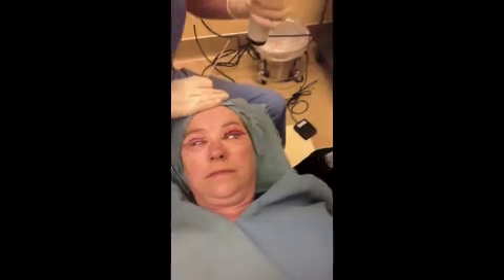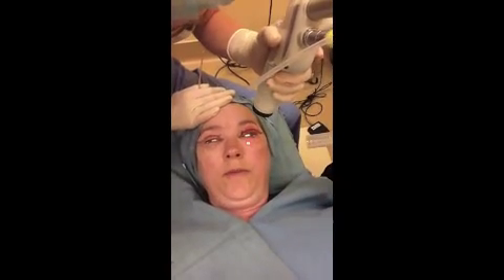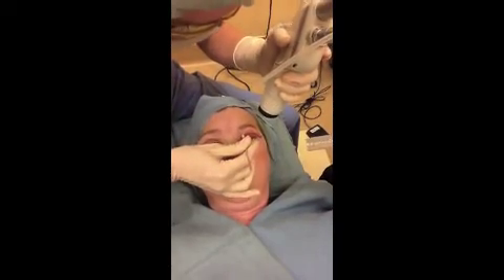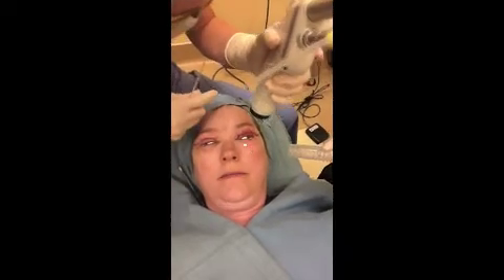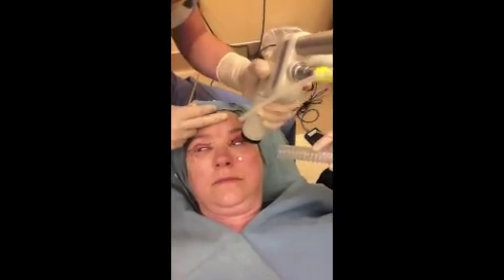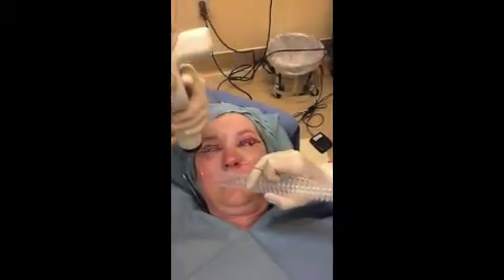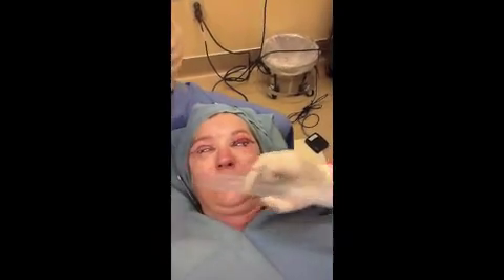Let's look for symmetry. Pretty good. Can you tolerate me going just a little bit down here? That was the most painful part. I know — hang in there. It'll be super, super quick. Wiggle those toes — wiggle, wiggle, wiggle. This is just feathering so that you don't end up with raccoon eyes. There you go. You did it. Perfecto. Awesome.